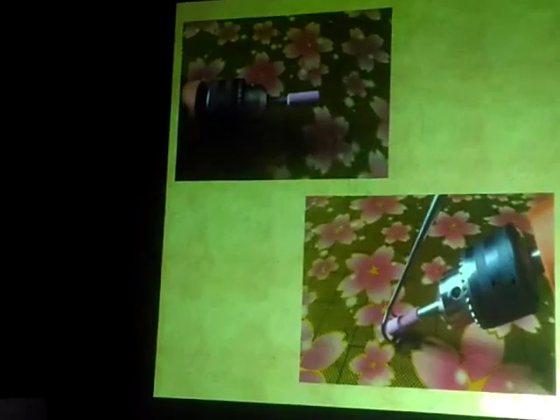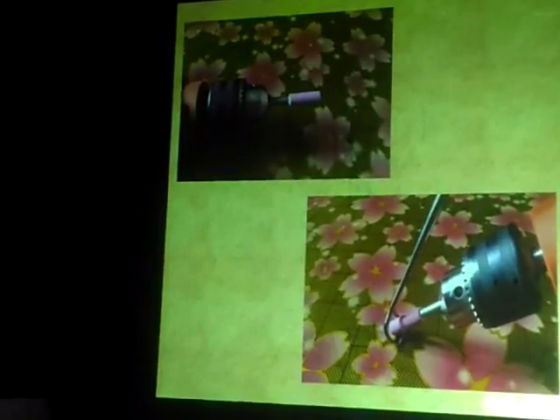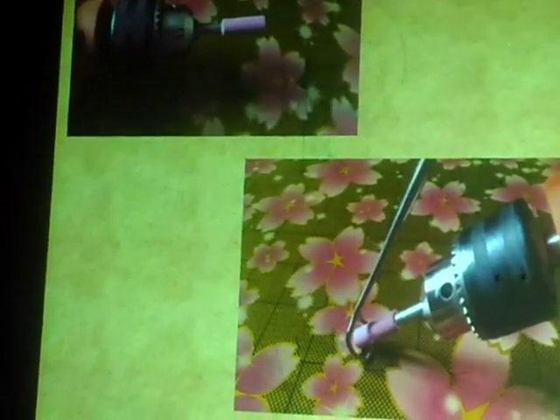If you are going to use an adenoid curette, you have to keep your adenoid curette sharp. And to do this, there is no recommendation about for how long you can keep your adenoid curette and when you need to sharpen it. However, I would say it depends on your rate of cases and number of your cases.